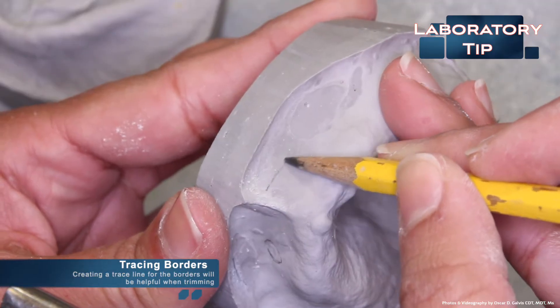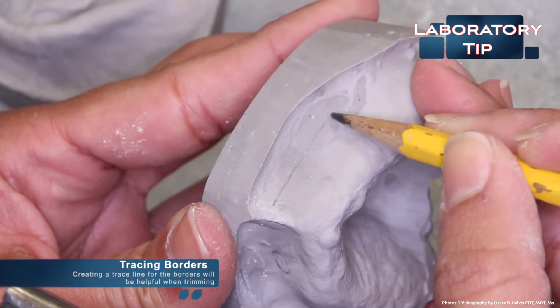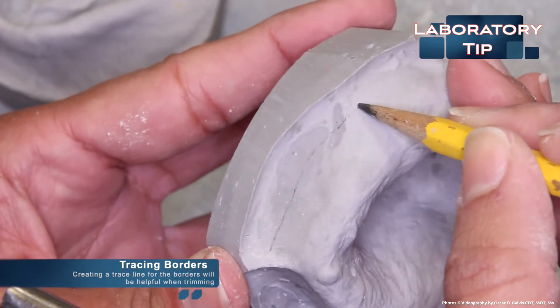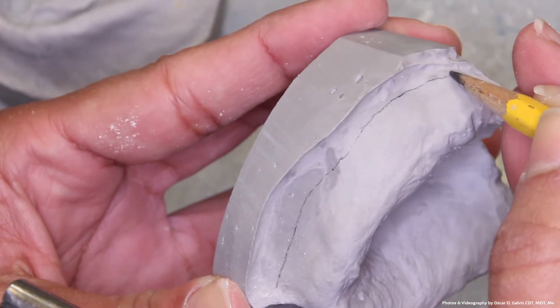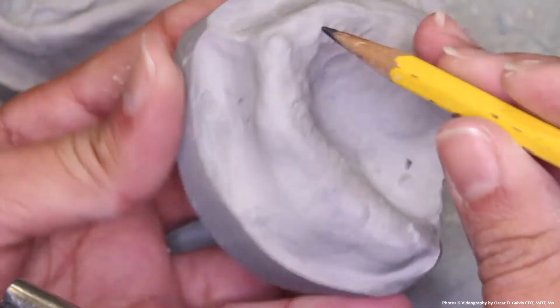Once all necessary adjustments have been made, use a pencil to create a trace line for the borders of the custom tray. It will be helpful while trimming the custom tray material.